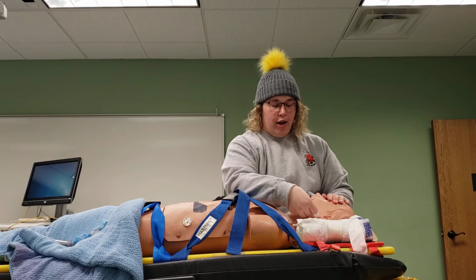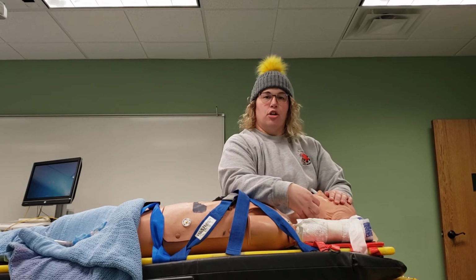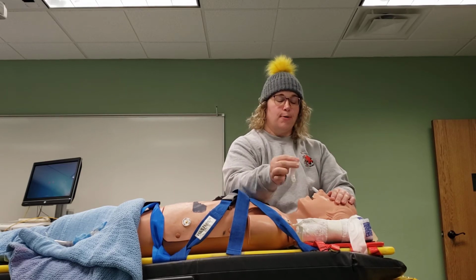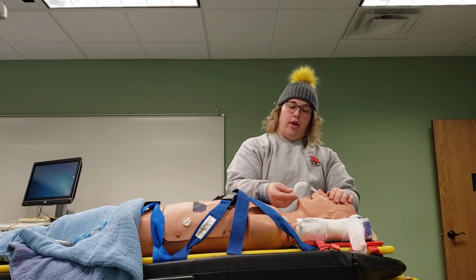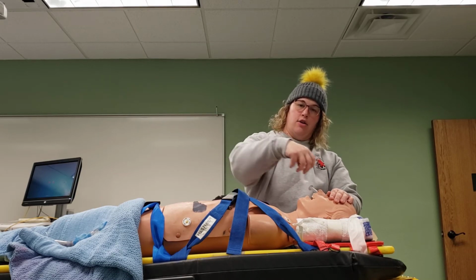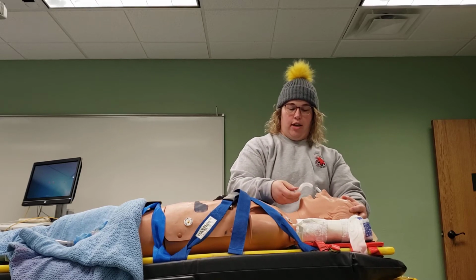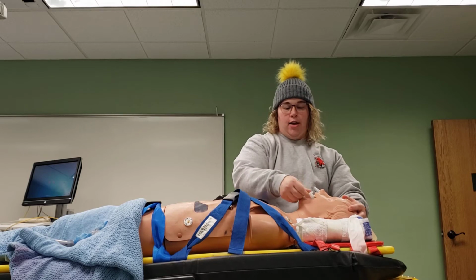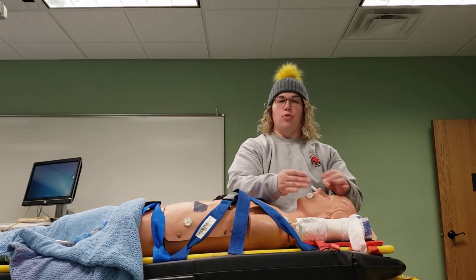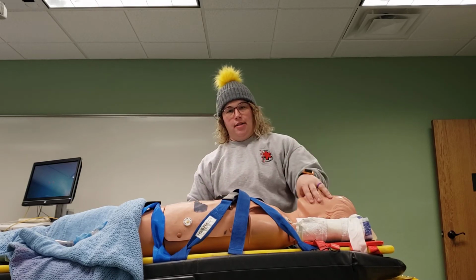OPAs, we measure from the ear to the tip of the mouth, making sure it's an appropriate measurement. Generally 70 or 7 and higher are appropriate for adults. Now, you can either do the straight in way or there are some that go in with a 180-degree twist. I'm a straight in person, so head tilt, chin lift, and just straight in until that trumpet part is at the edge of their teeth or their lips, and then you begin ventilating them. So that's the BLS airway, right?